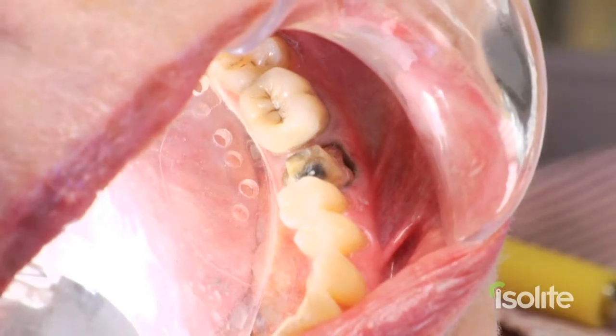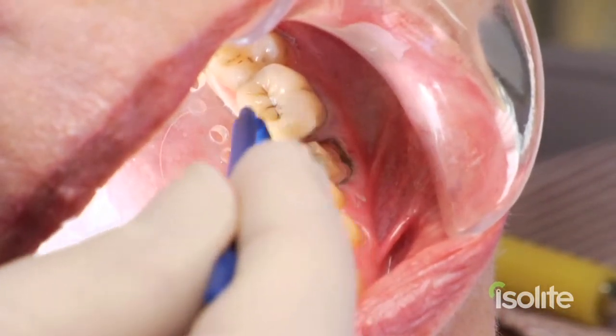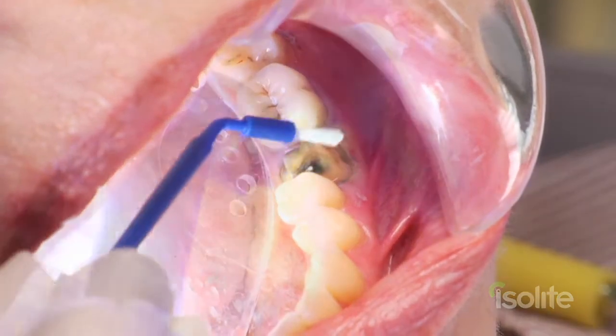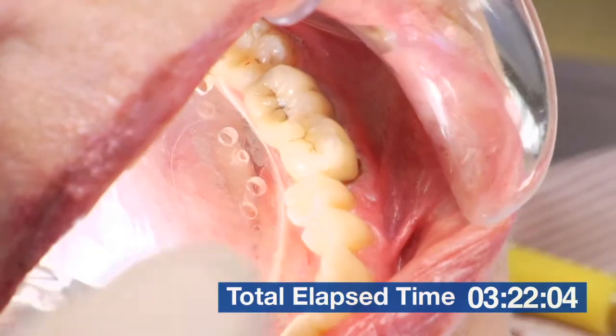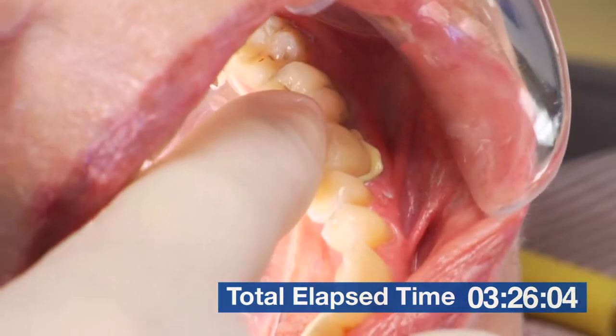We've already checked the fit, the contacts, the occlusion, and the aesthetics. So let's go ahead and bond and cement this. 10-second light cue. Typically we don't use cheek retractors in our office, but we're utilizing one today so that you can get a better view of our procedure.